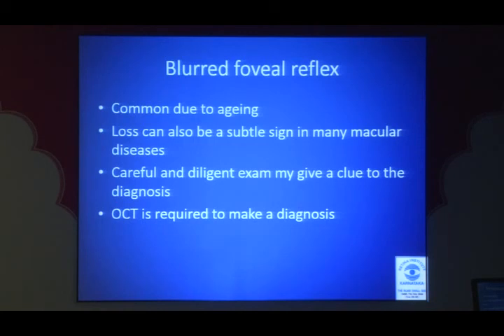Even having the OCT, as I have emphasized to you, the decision making may not be so easy as to what to do with a patient, like in the patients with ERM. So with that, I conclude my talk. Thank you very much.